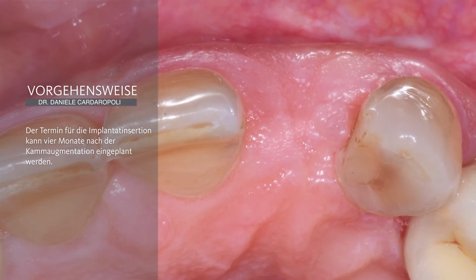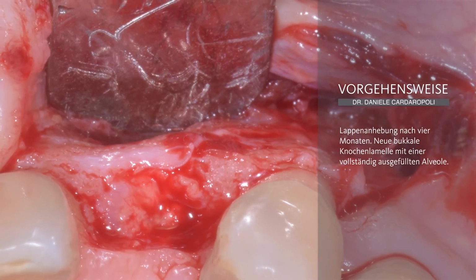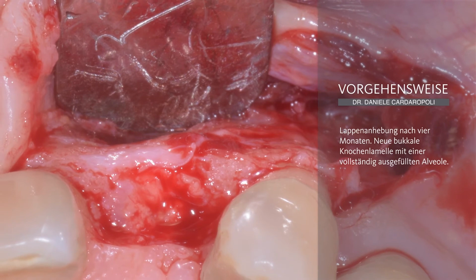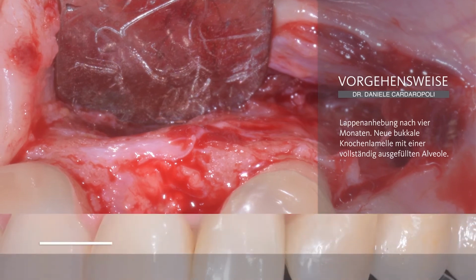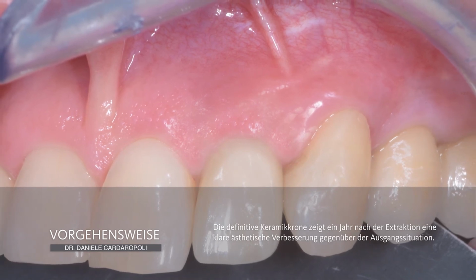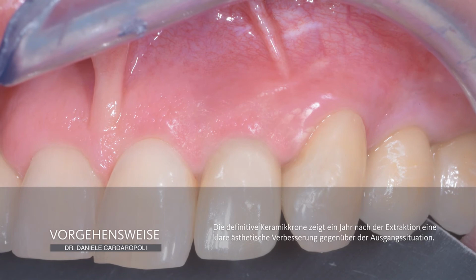After 4 months, at the reopening, we can see a complete bone filling of the previous socket with the reestablishment of the buccal bone plate. This will lead to the insertion of a prosthetically guided implant with a final ceramic crown that shows an aesthetic improvement when compared to the baseline.